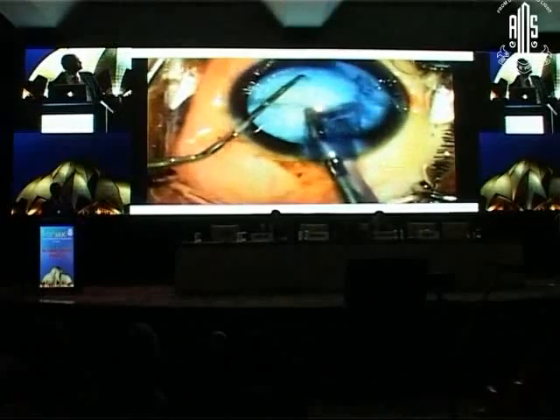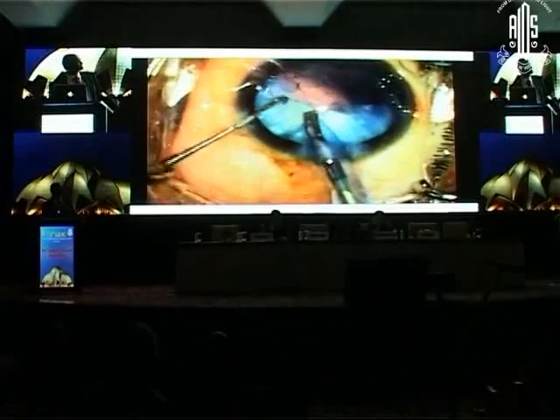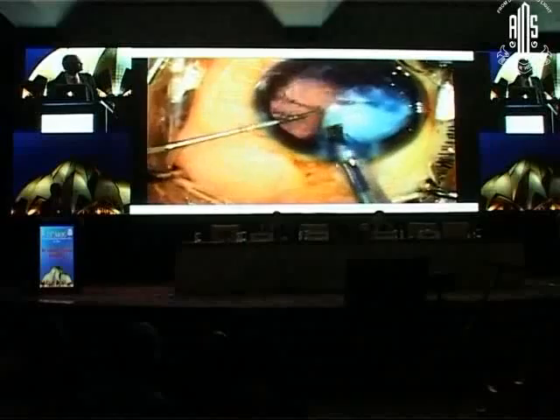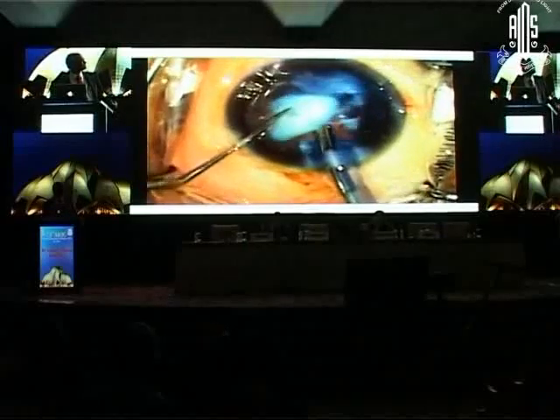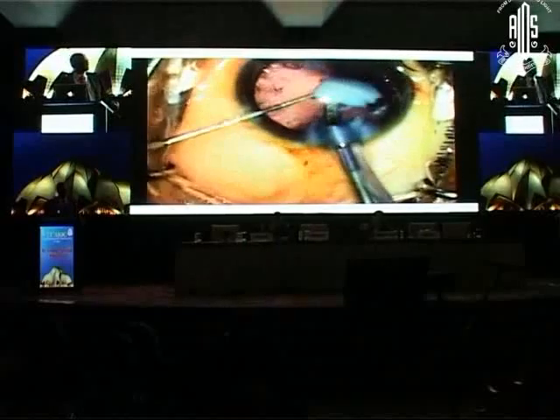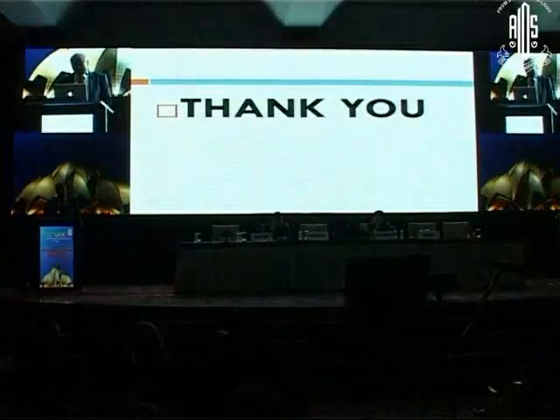Now here you will see this. It comes in less time than the soft nucleus. See this, because this is a soft cataract, and you will have to see that. You will have to see this before, in the slit lamp examination, and then you can go ahead. So this was about the phaco dynamics and how that is applied, and thank you very much.